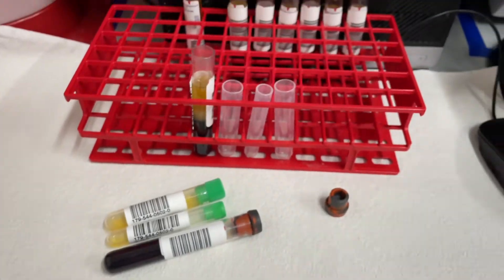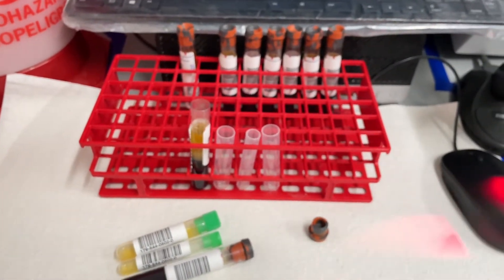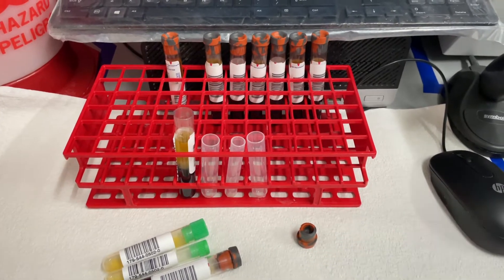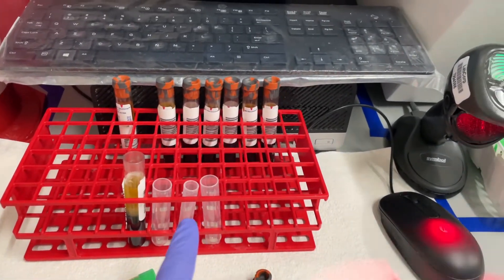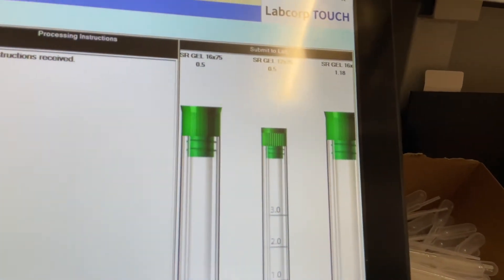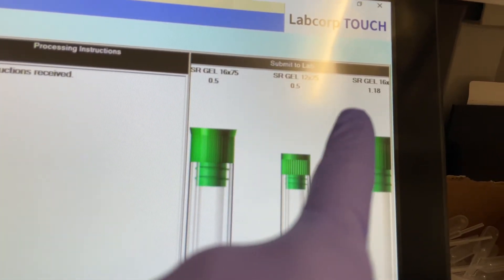We're back here in the laboratory. After I drew my patient's blood, I put my SSTs on a rack so they can clot for 30 minutes. After that, I spin them in the centrifuge, then I take my SST and scan it. As soon as I scan it, instructions come up on the computer screen telling me what I need to do to prepare my specimens for the scientist.